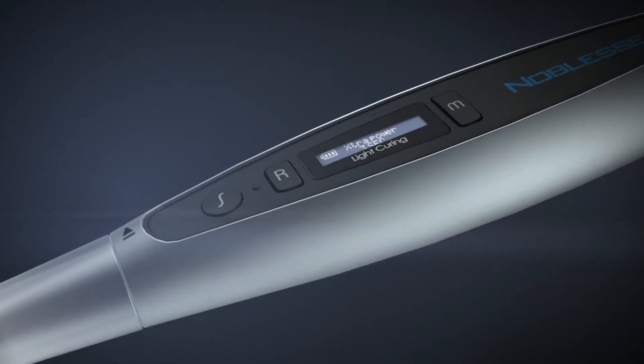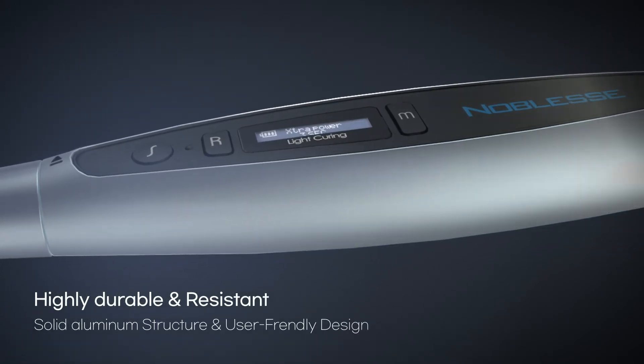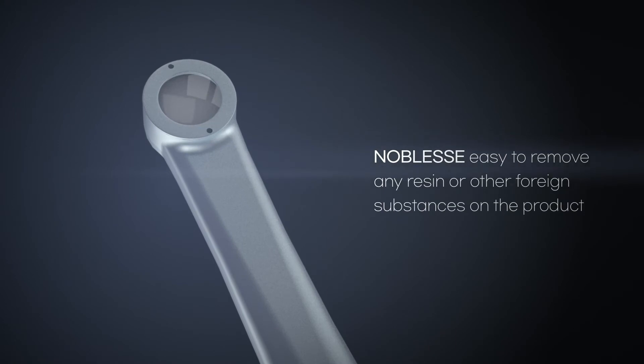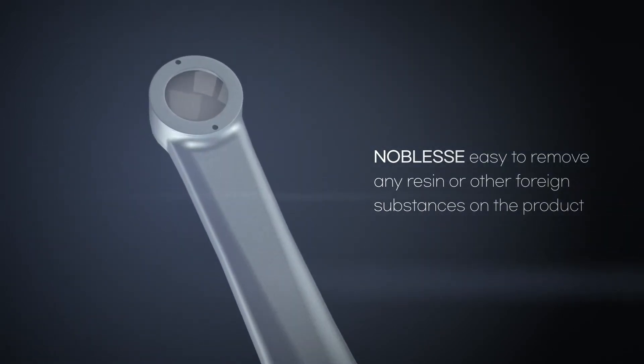Noblis is constructed with an aluminum alloy metal case. It is highly durable and resistant against external shock and chemical cleaning products. Compared to other plastic curing lights that break down frequently when dropped or disinfected with chemicals, Noblis is solid and robust.